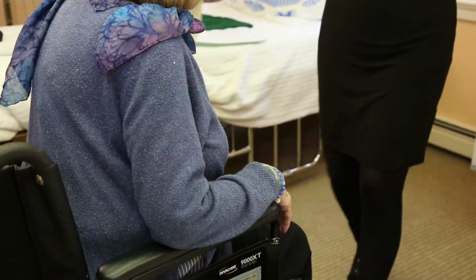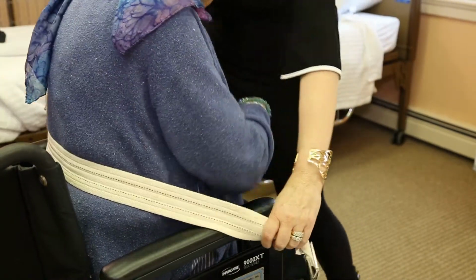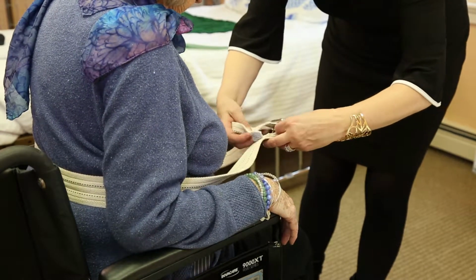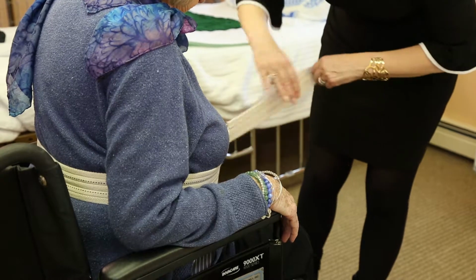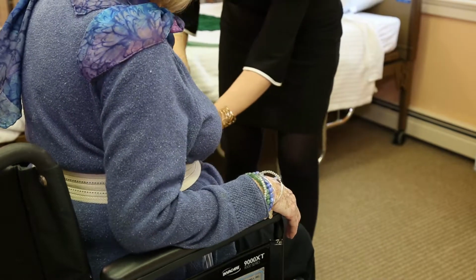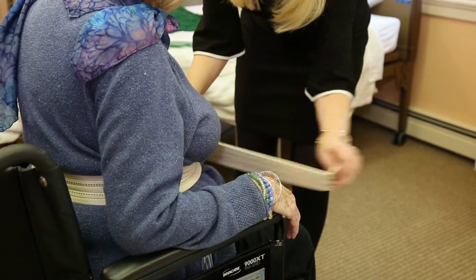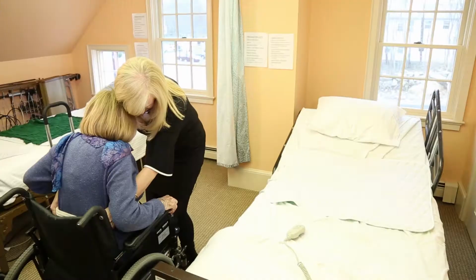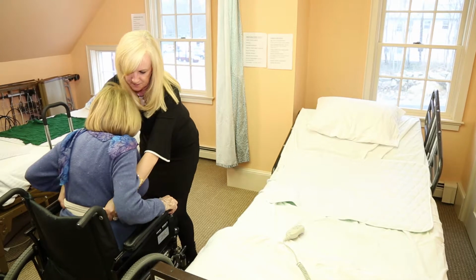Next, we are going to transfer the patient from the wheelchair back to the bed. Please put on the gait belt, and the same rule applies. Make sure that it is securely fastened and that you can get 3 fingers between the gait belt and the patient. Have the patient put her arms on your shoulders.